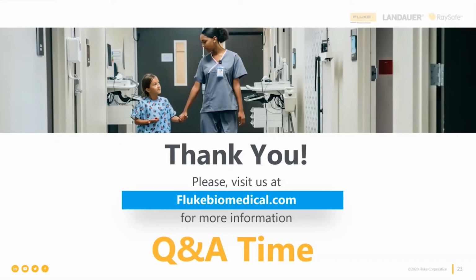Yeah, sort of a similar, well, not similar, but also about a product. Is this accessory, the 7010 load box, compatible with the DNI 4000 product? No. It is not. And the DNI 4000, by the way, is obsolete and out of its service life. So you're using something that can't be repaired. I'd be trading that in.